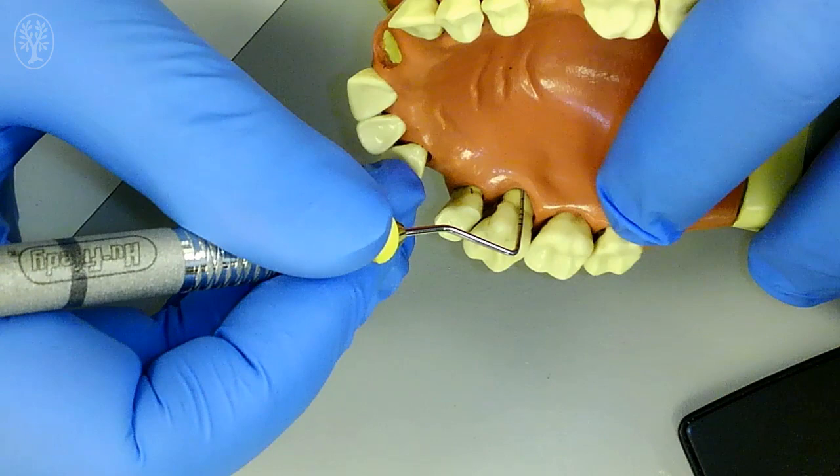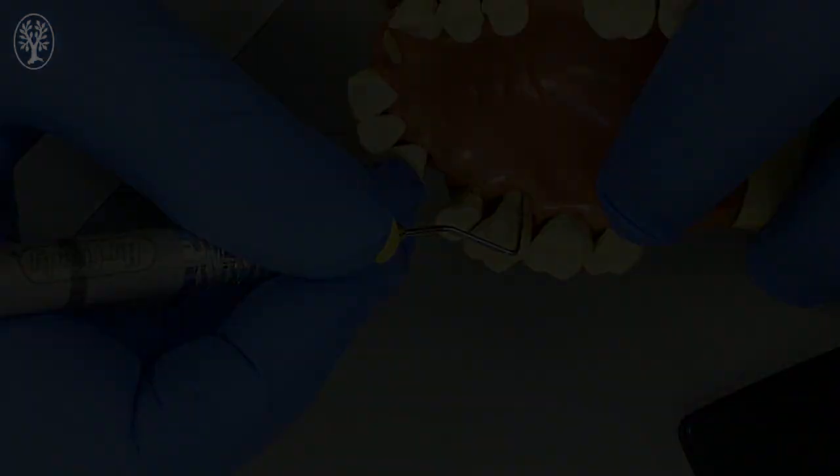For midlingual and midfacial surfaces, recession added to probe depth gives the attachment level, so 3 mm for pocket depth and 4 mm of recession gives 7 mm of attachment level. One can also say, since the clinical attachment level in pristine periodontal tissue is 0, the attachment loss equals the clinical attachment level, which is 7 mm.